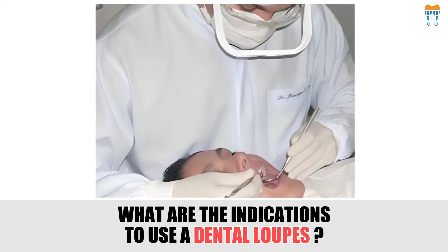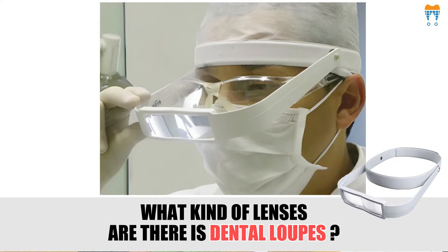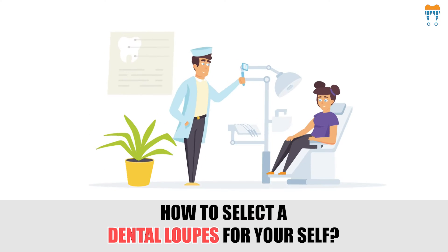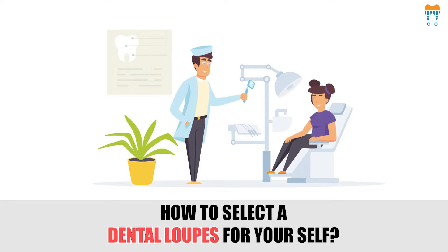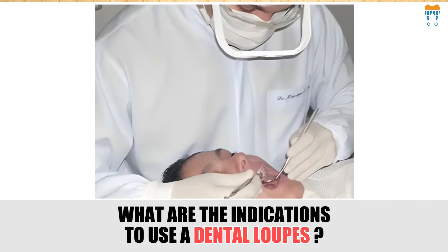To simplify all of these, we have come up with four important topics to discuss about dental loops: number one, what are the indications to use a dental loop; number two, what are the kinds of lenses in dental loops; number three, how to select a dental loop for yourself; and number four, field and magnification. Let's dive into the first topic — indications for why to use a dental loop.